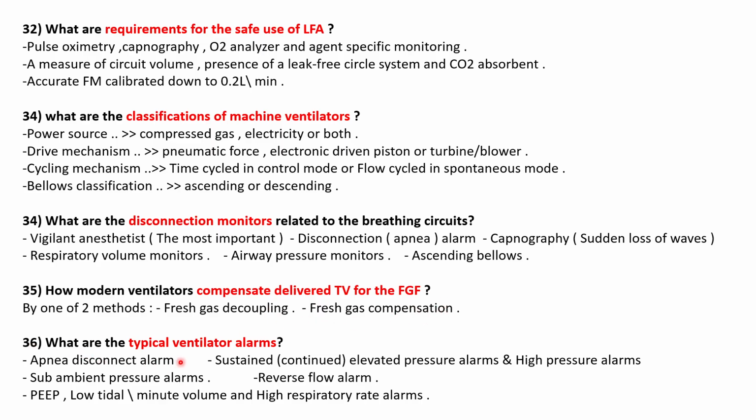What are the typical ventilator alarms? Apnea, disconnect alarm, sustained elevated pressure alarm, high pressure alarm, subambient pressure alarm (not in all devices), reverse flow alarm, low tidal volume, low minute ventilation, and high respiratory rate alarm.